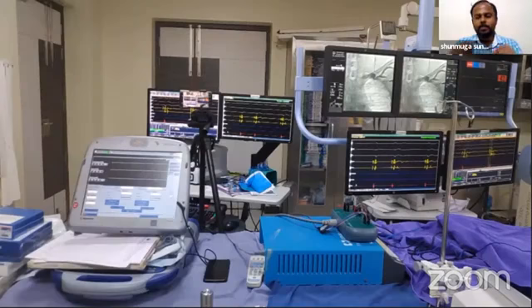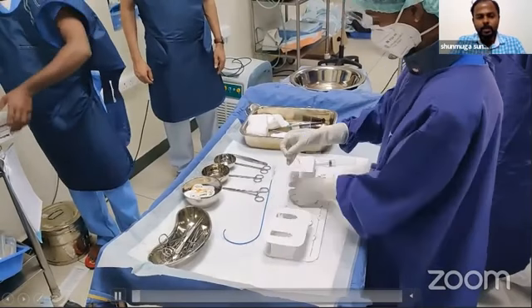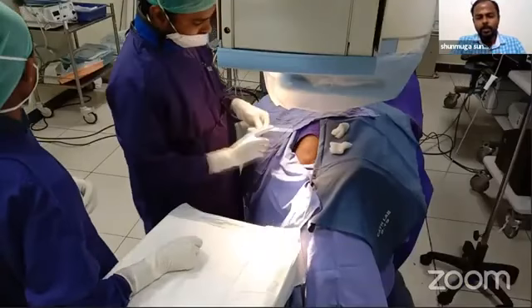So this is a typical EP lab setup. This is in fact the same for doing a His bundle pacing also. So you need to have an EP system as well as the fluoroscopic screen in front of your eyes while doing the procedure. And the PSA will be there to assess the lead parameters. And this is the catheter which I've shown you. So the same His catheter which we are using for doing His bundle pacing. And currently there is one catheter available, which is a non-deflectable C315 sheath.